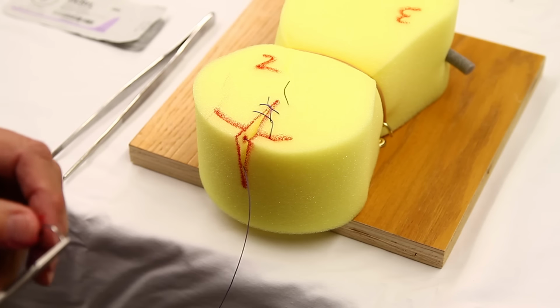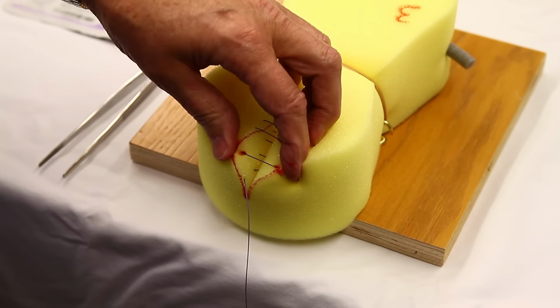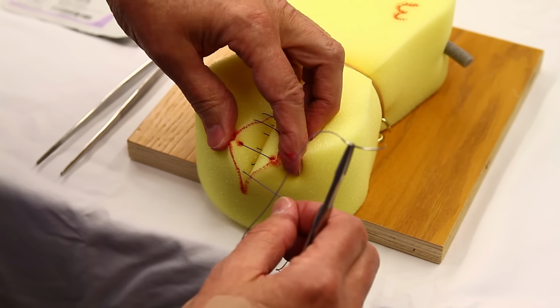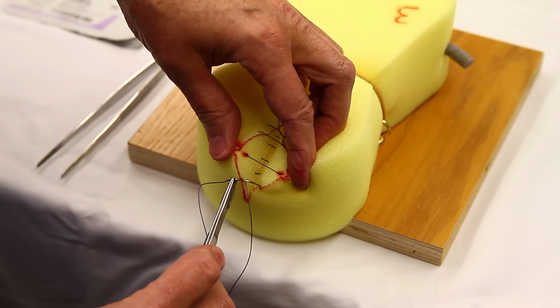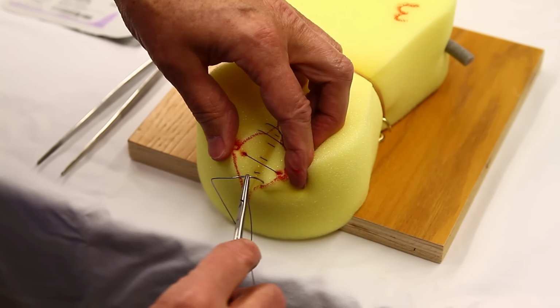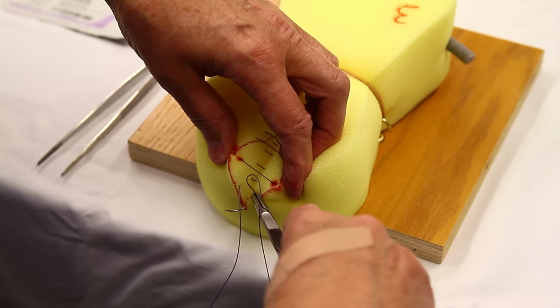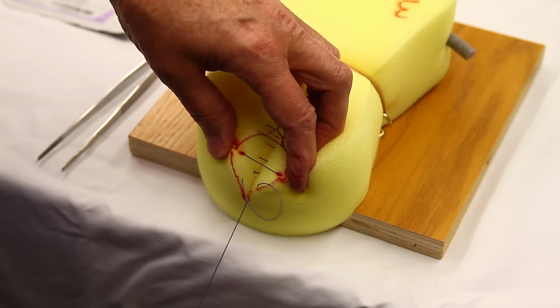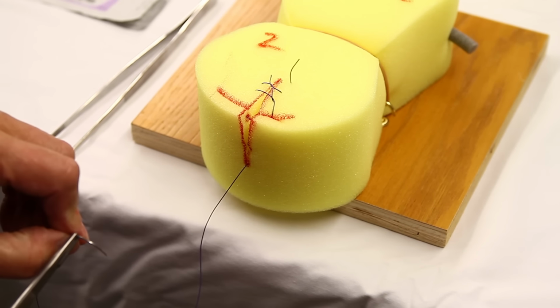Now we're going to transition to subcuticular. We've closed most of the laceration. We're going to go straight across, and if you wonder where straight across is, just lay your suture across a couple of millimeters away from the skin surface, go all the way to the apex of the laceration down toward near the rectum, but stay inside. Carry that suture through, and now we're switching to subcuticular.